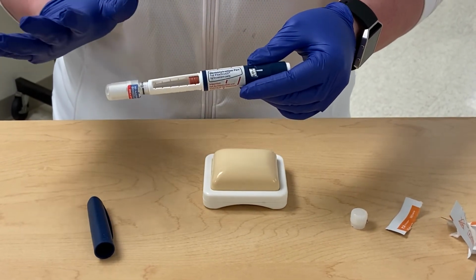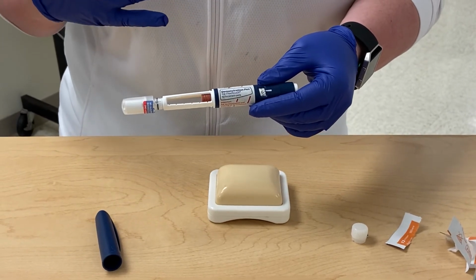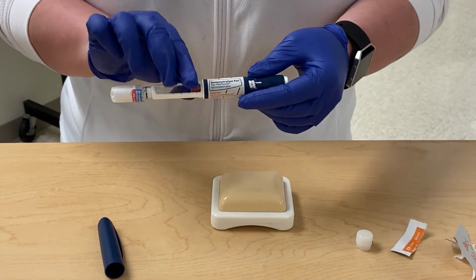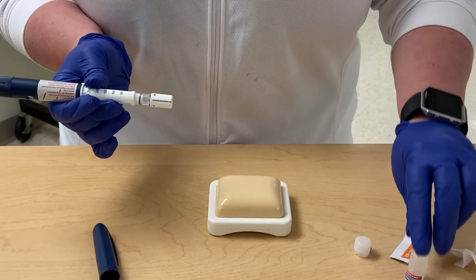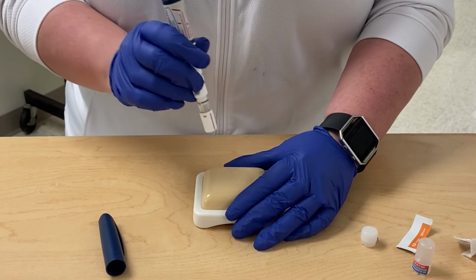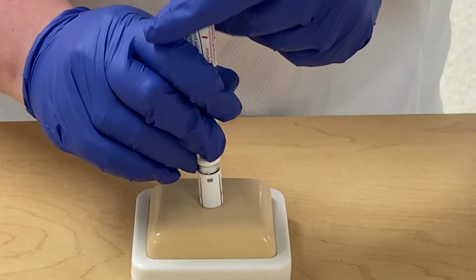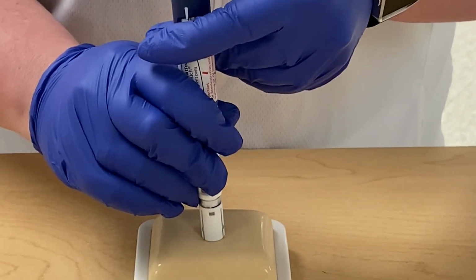Once everything's been double checked with the dose, the order, and your patient was verified, the area of the skin should be dry. You're going to stabilize this, take the cap off. You're going to stabilize the skin with your hands. You're going to compress the needle into the skin, and then you are going to compress the plunger to administer the 6 units of insulin.